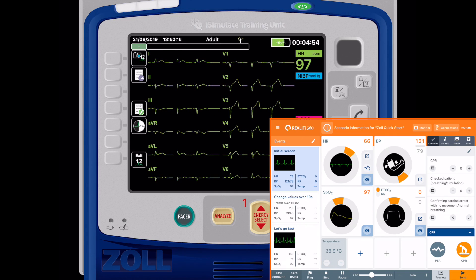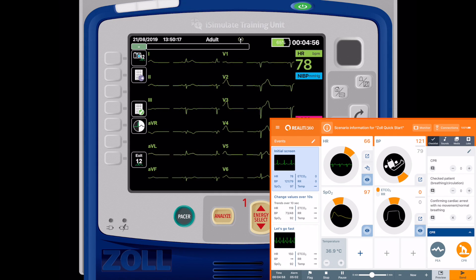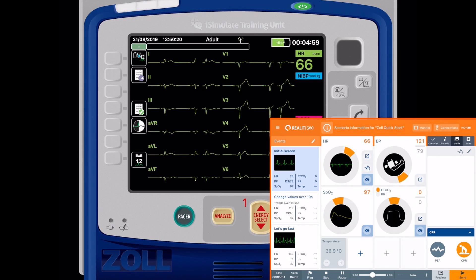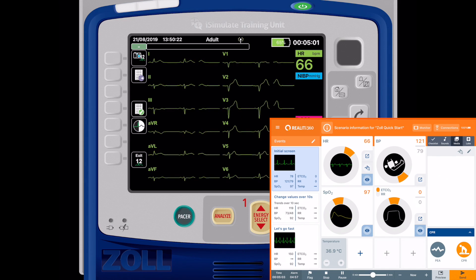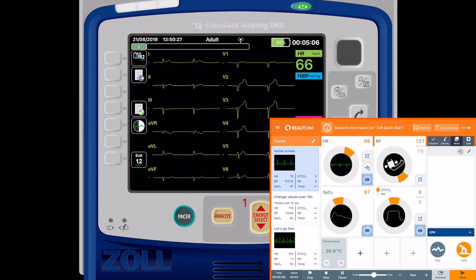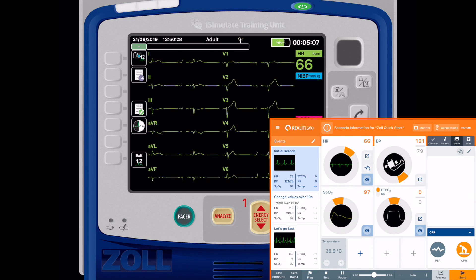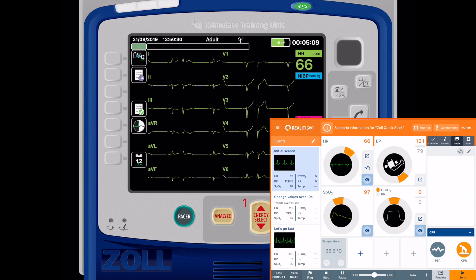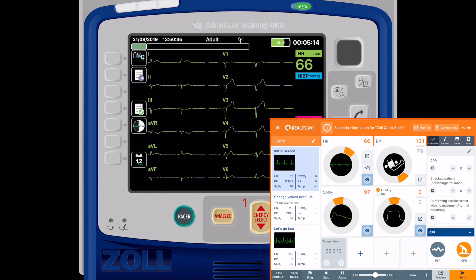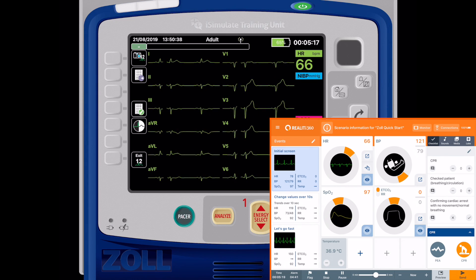If you want to send a 12-lead to chart, then you go into media, tap on the 12-lead button here and that will send the 12-lead ECG that you're currently doing to the chart part of Reality. So that's a quick run through of the new 12-lead functions in Reality360.